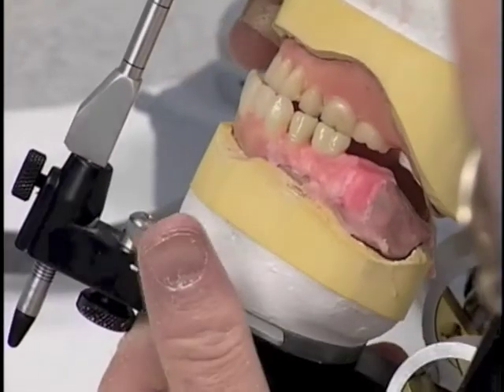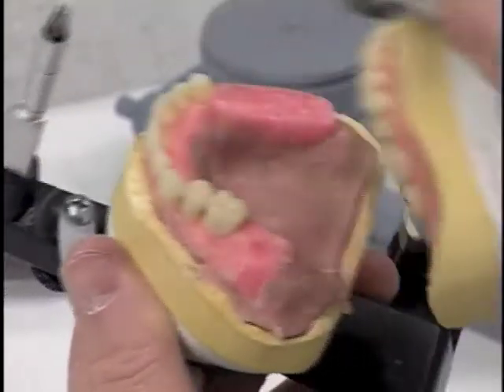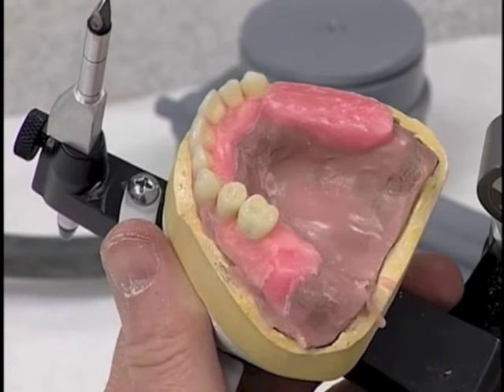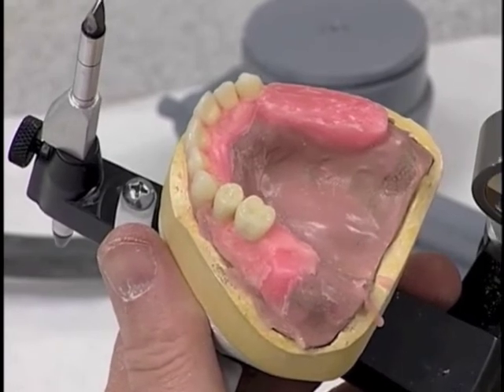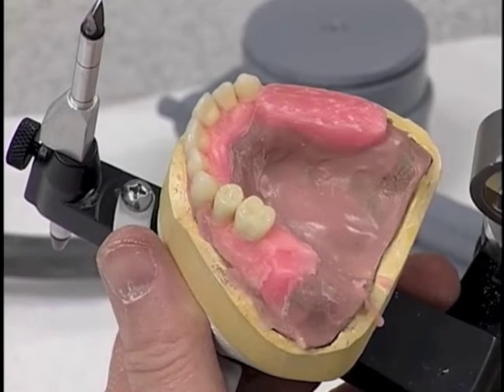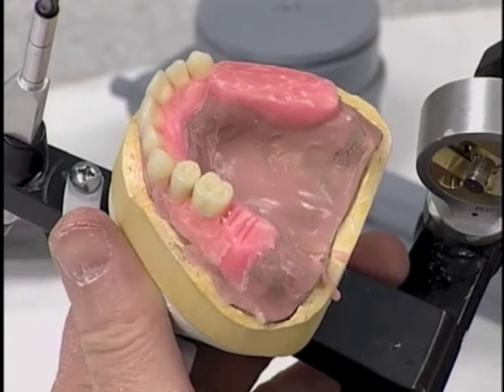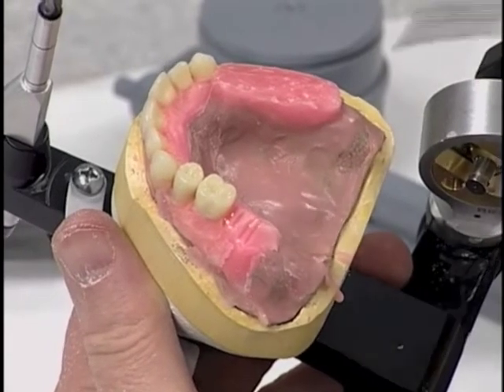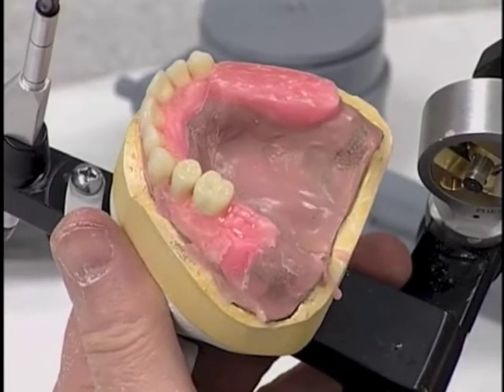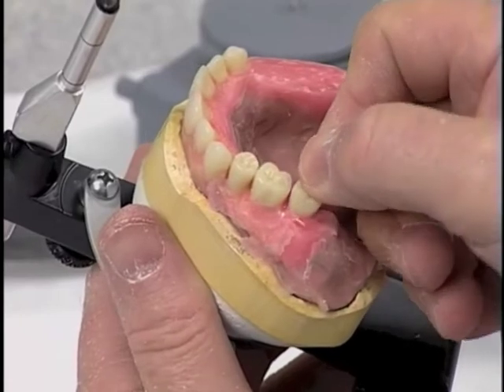We have good occlusion of the maxillary and the mandibular. The tooth seems to be in the correct position. So now once we have that tooth in position, we're going to pull wax for the second molar. We will attempt again to place the second molar, hopefully without interferences.